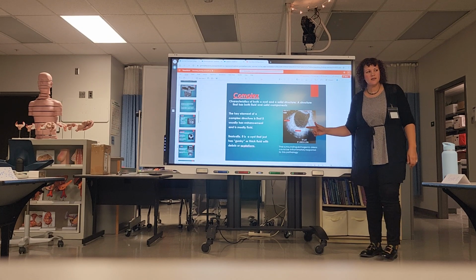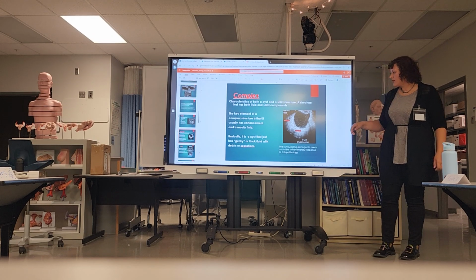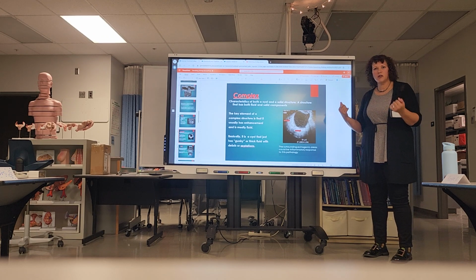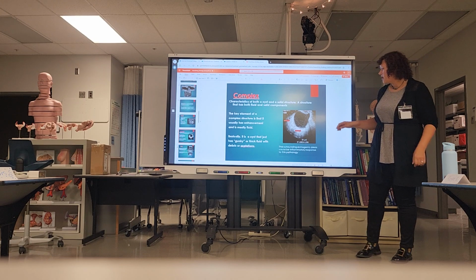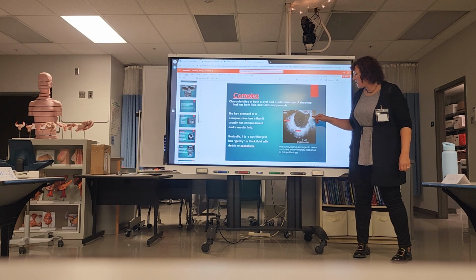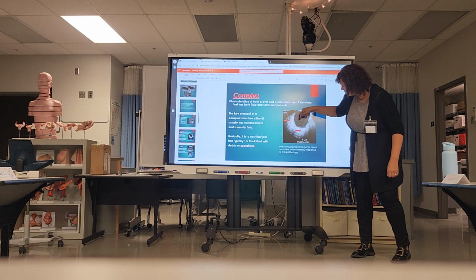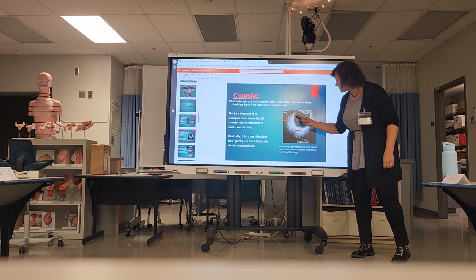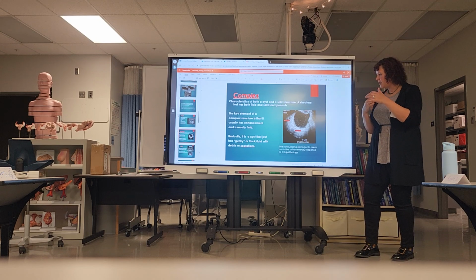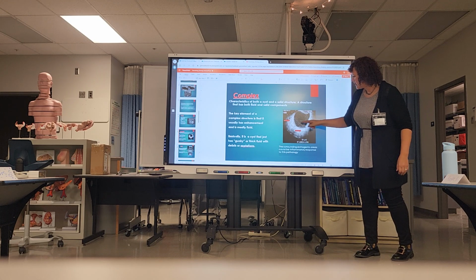So we get cysts all the time in our ovaries, and they pop. We would never know. Sometimes if you feel a sharp pain down there, that might be an ovary cyst popping. But sometimes they can be filled with blood. That's a hemorrhagic cyst, and we know that it's filled with blood because now we have all these echogenic strands going through it. So as blood sits for a while, it becomes fibrous, and it starts making kind of a lacy pattern. So that's what that is.